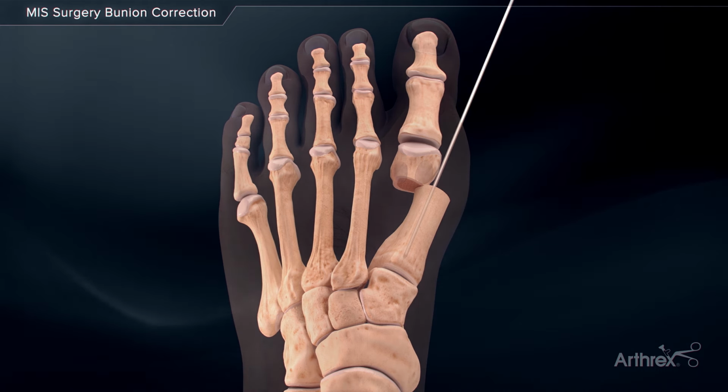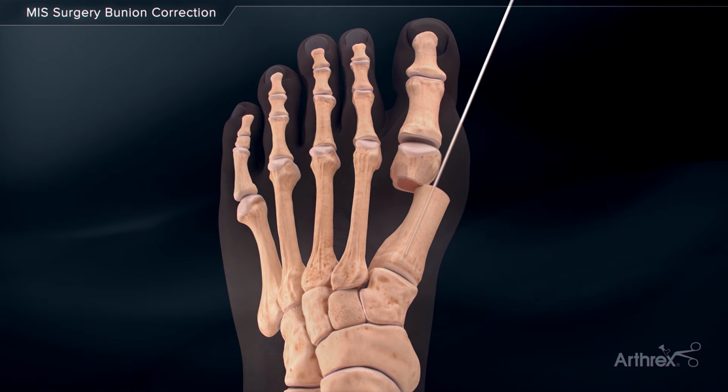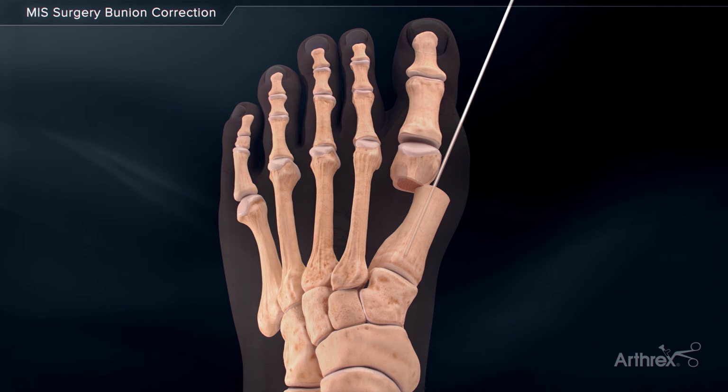This will help maintain the lateral and rotational translation of the capital fragment. At this stage, the hemostat can be removed if desired. The capital fragment can be supinated manually via the hallux to correct the sesamoid position further.